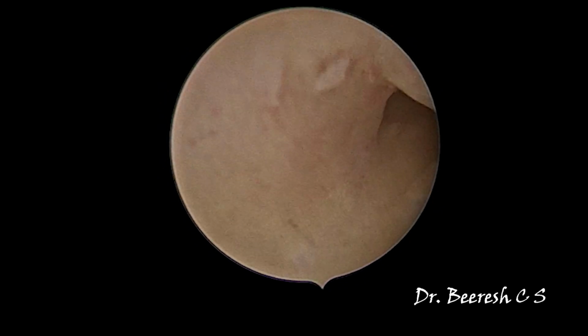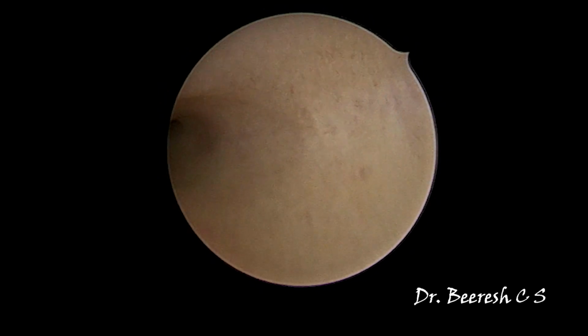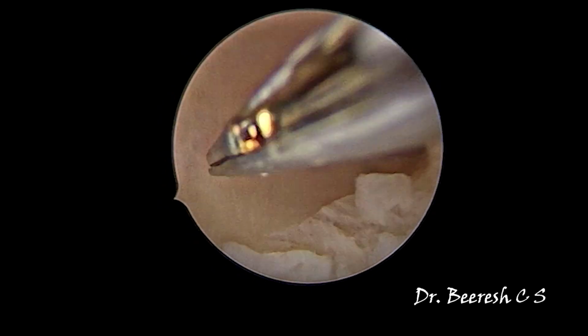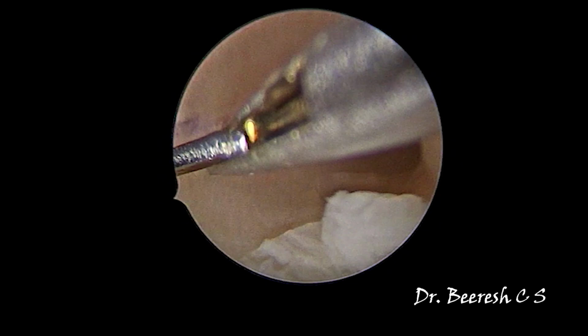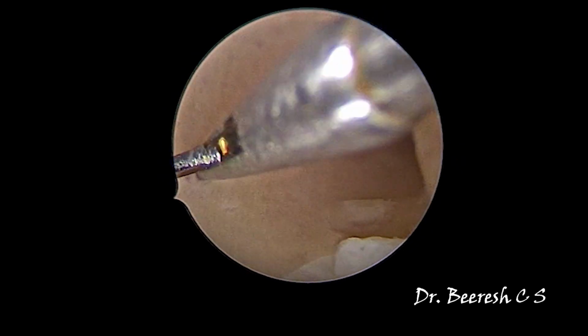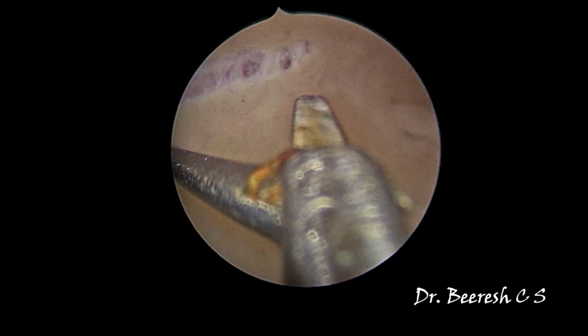There is also some fundal projection, which shows more than 50% of the myometrial thickness. So there is some amount of septate component as well.